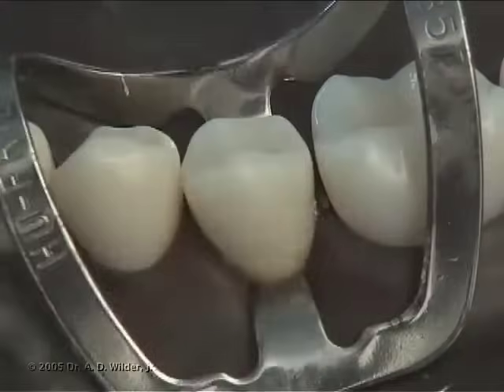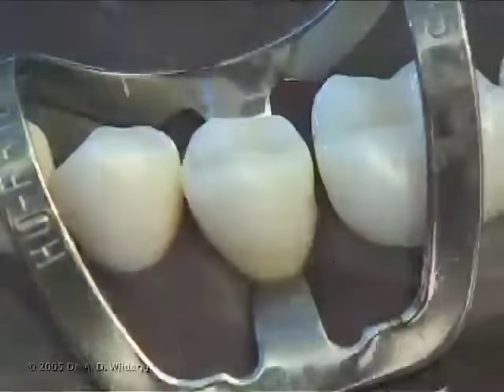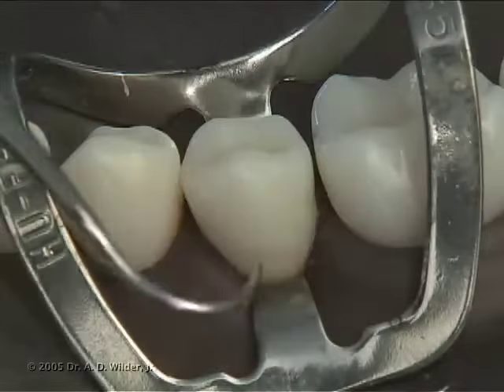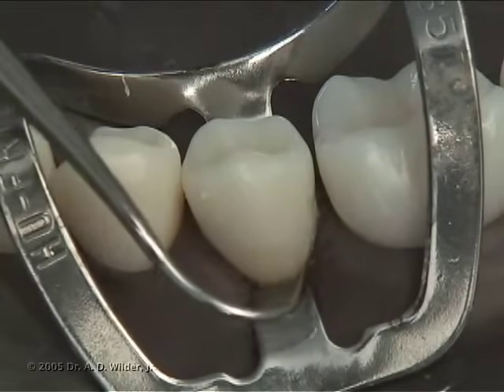Once you're happy with the contour, cure for about 20 seconds or as directed by the manufacturer. Check for any material deficiency with an explorer before moving on to the next step.